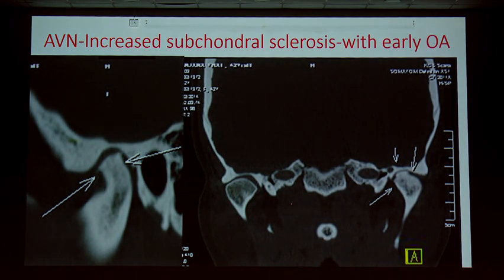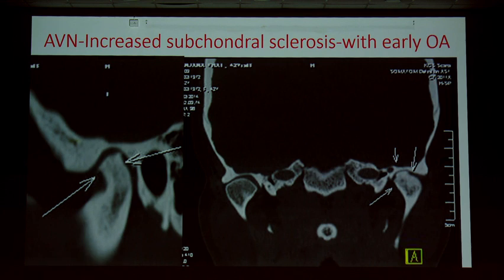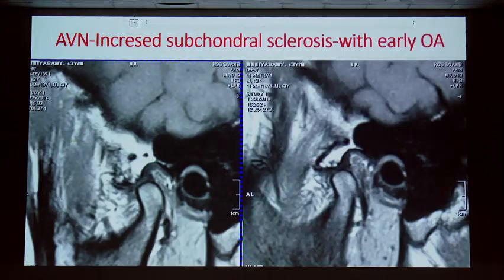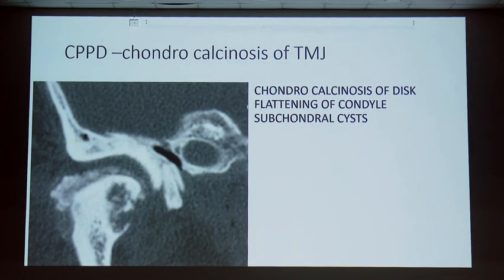Avascular necrosis shows more prominent subchondral sclerosis. The double line sign — a low density area beneath the subchondral bone — can be carefully identified. The condylar process shows typical avascular necrosis changes.